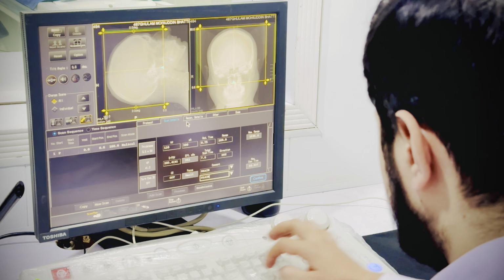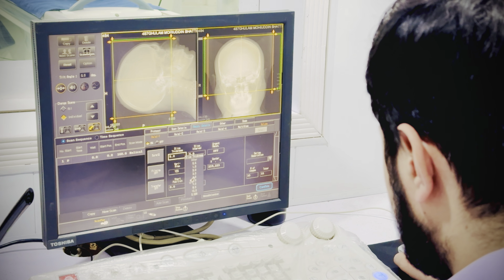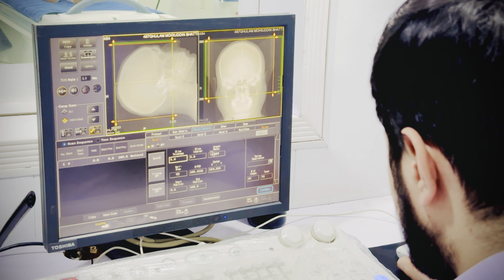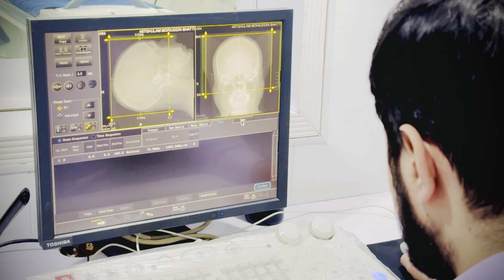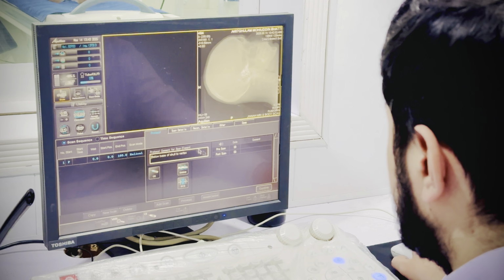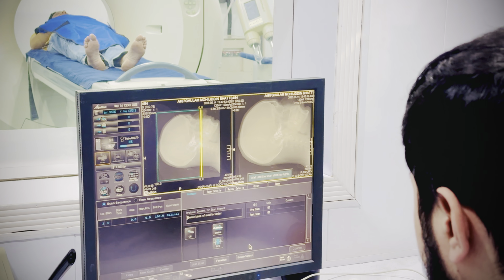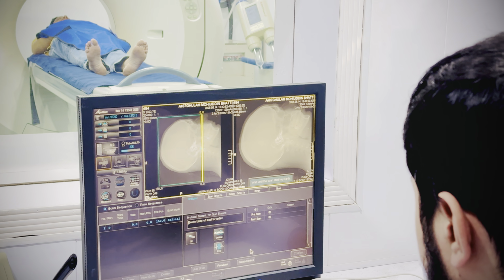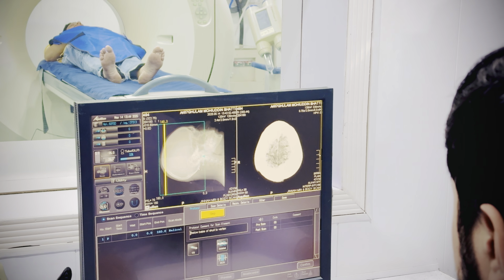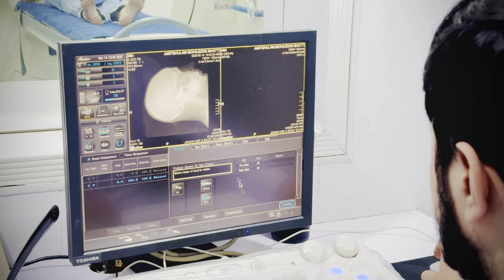Heading to the scan parameters, the slice thickness should be about 5 mm, which is the standard protocol, and as per department protocol, around 2.5 mm for posterior fossa. Start of the scan. Instruct the patient again to stay still to reduce motion artifact. Begin the scan from the base, which is the foramen magnum, to the head, which is the vertex. Observe images during acquisition for any urgent findings, such as large bleedings, hemorrhages, or any fractures visible.